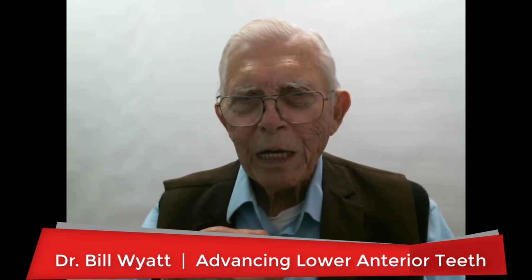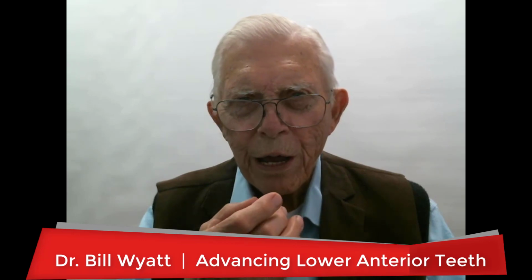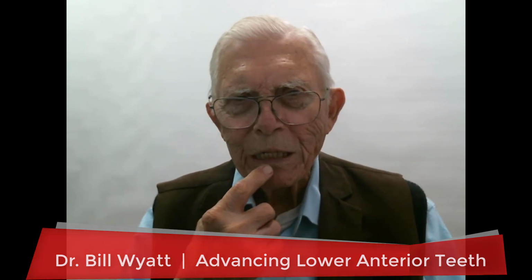I want to talk to you about a very important thing if you do a lot of advancing of lower anterior teeth, especially if you have somebody who swallows and uses a real tight lower lip here. Your lower lip can pull back with a tremendous force against the teeth. And if you want to move these teeth out into that space, you've got to run interference for them, for you have to have a soft vascular bed for the teeth to go, where bone can form in that area. So that's where lip bumpers come in.